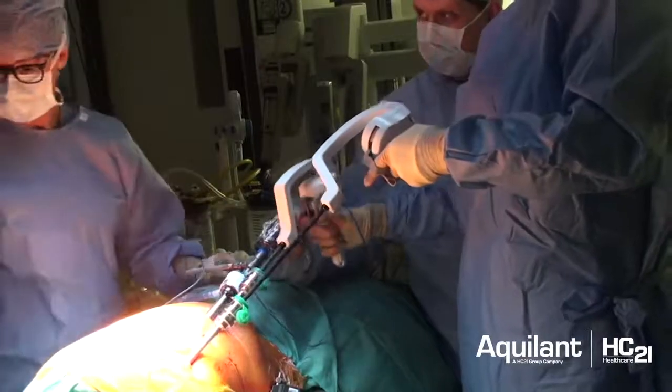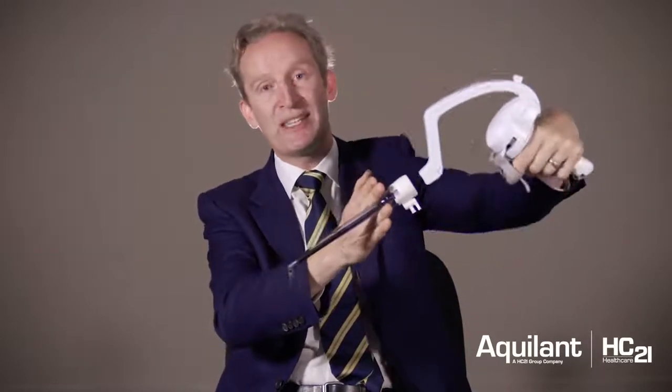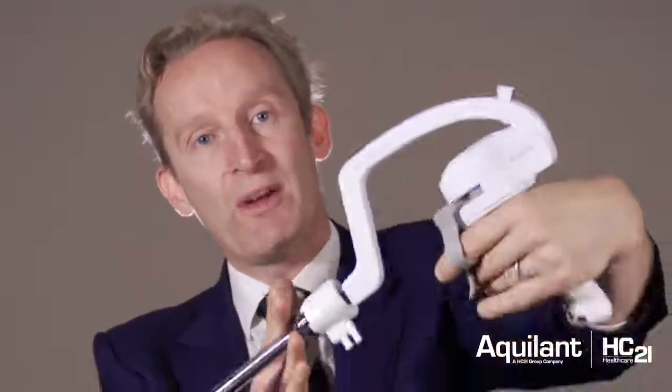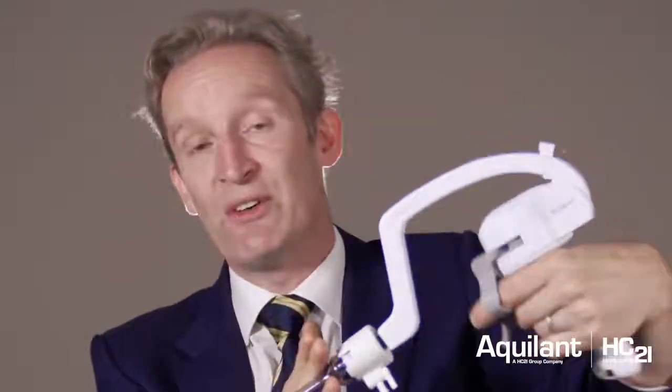One wonderful thing you're going to really enjoy is being by the patient's bedside. I had quite a lot of anxiety about the fact that when coming to the patient, maybe I'm not going to be able to reach over far enough or use the wristedness from a far distance. But don't be too worried about that. If you practice at home having your hands quite far away from you with the instrument coming towards yourself, you can really get over that anxiety because you can spread your hands quite widely and work inwards and still successfully use these wristed instruments.